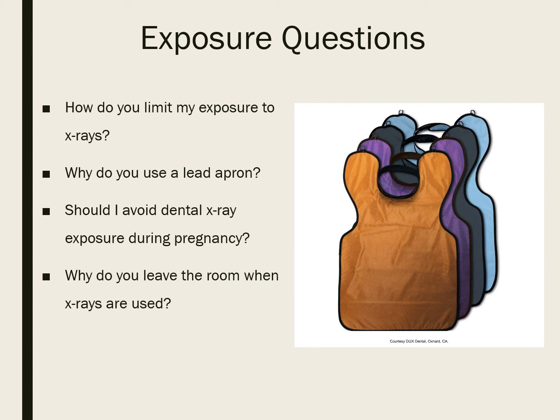Should I avoid dental x-ray exposure during pregnancy? So the American Dental Association got together with the Food and Drug Administration, and they found that with the use of a lead apron, there is almost zero radiation able to penetrate the lead apron and travel toward the fetus. And so there is no longer a recommendation that says you cannot take radiographs during pregnancy. They are safe to take during pregnancy.